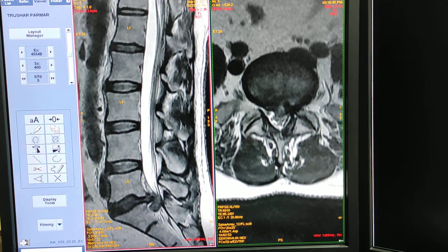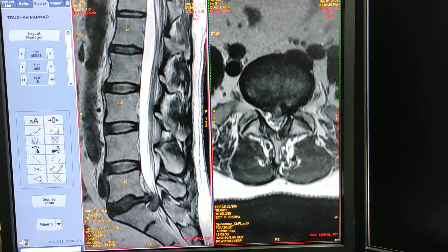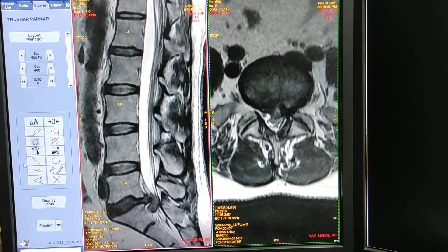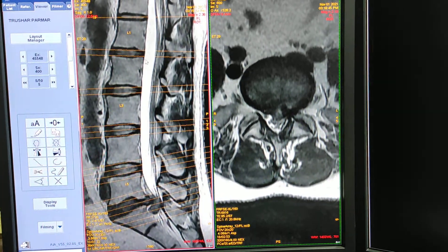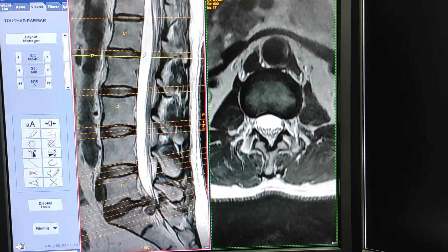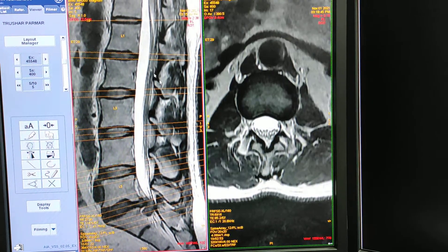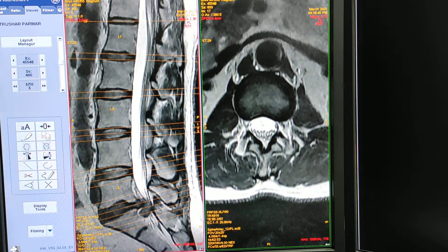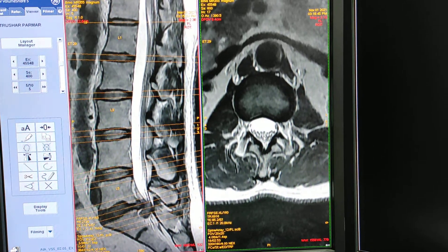Now I will show you the same thing on an axial view and correlate it with the sagittal view. First of all I will show you the normal appearance of the disc. This white area is the CSF.